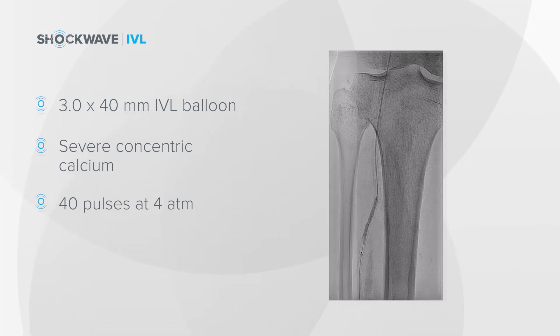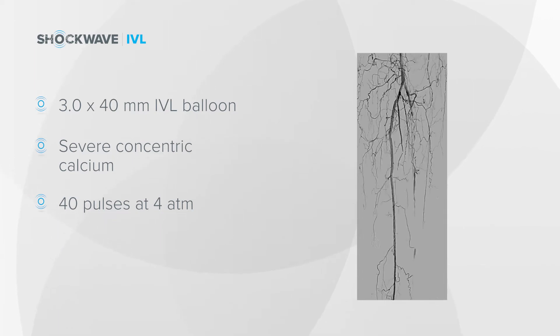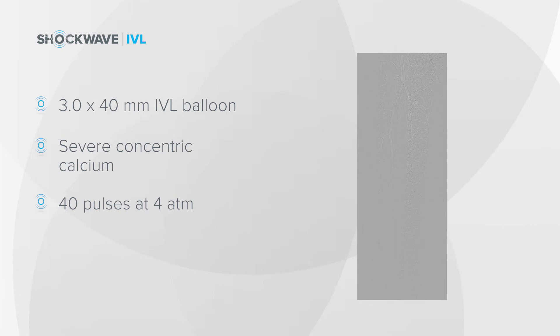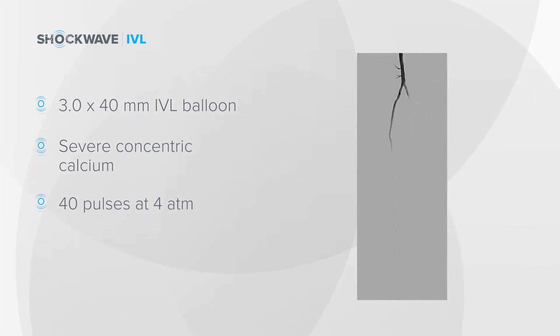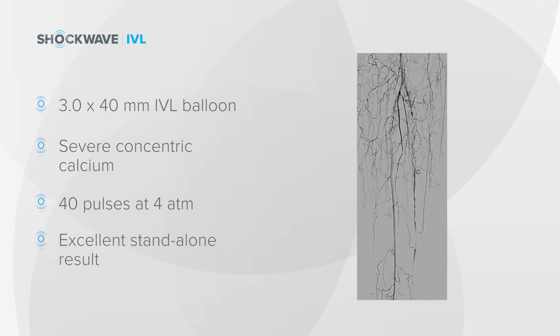This video over here on the right demonstrates the outflow down the anterior tibial after that single 40 millimeter balloon inflation in the proximal anterior tibial — a really good standalone result to the anterior tibial in this case.